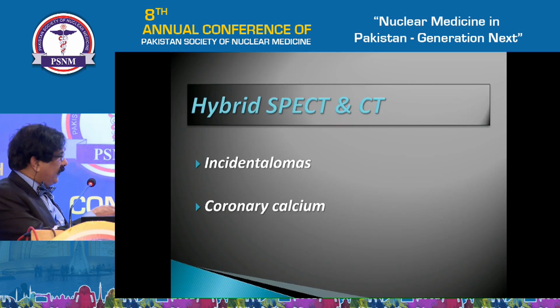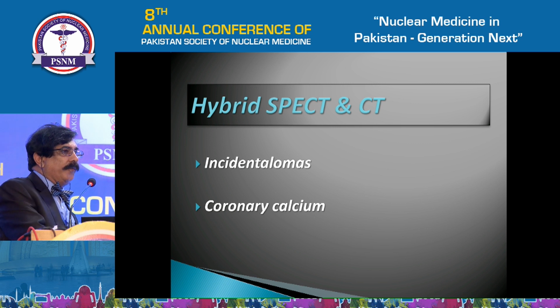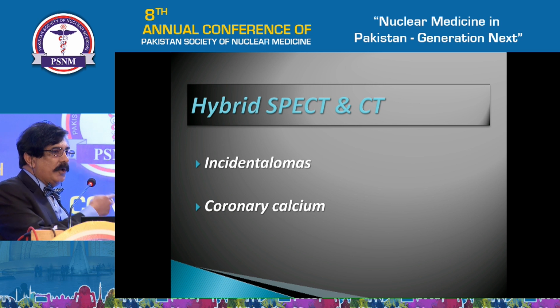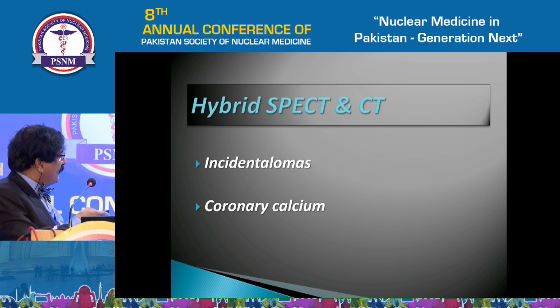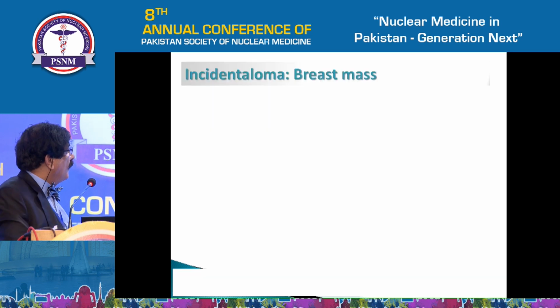This is something I did 3-4 days ago. You can actually look at your myocardial perfusion scan with the SPECT CT scans and look at the low resolution images for incidentalomas, and also look at a qualitative rather than quantitative picture of calcium scoring.